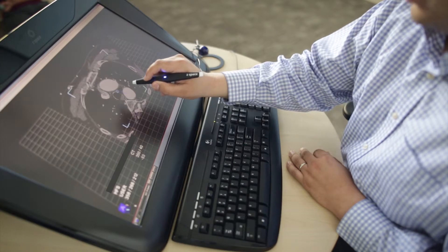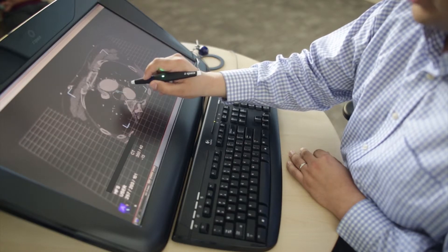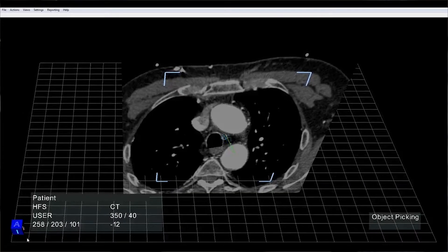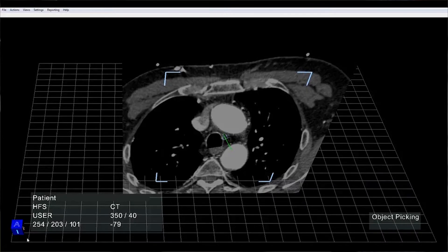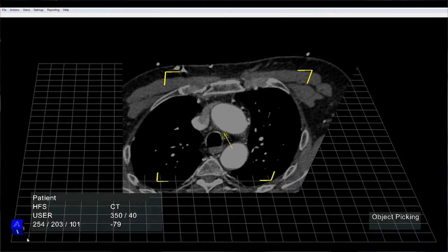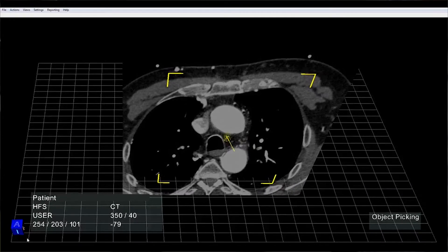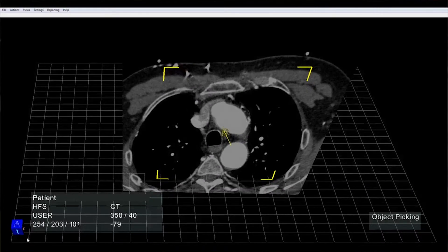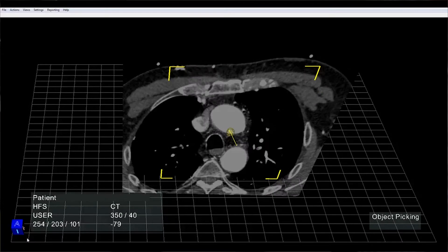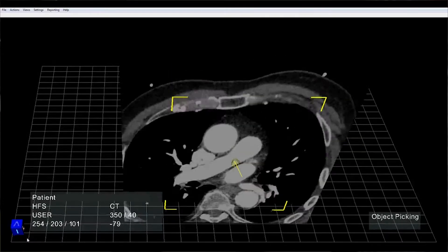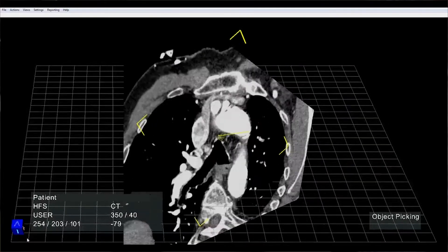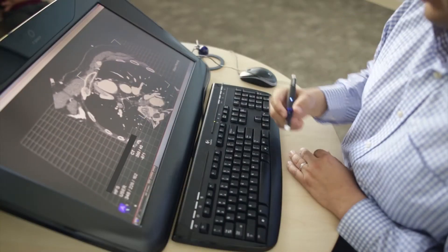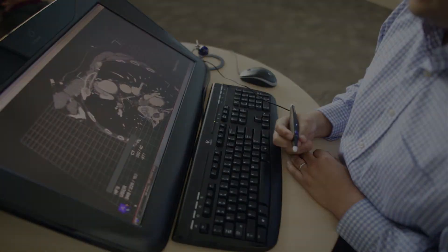You can select the cone in the center, which is this blue wireframe cone. Once you have it, press the front button — the corners and the cone become yellow — and you can change the orientation and translate the cross section of the views that you're generating.